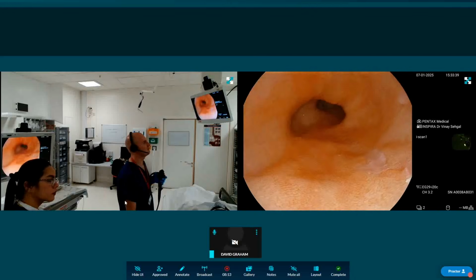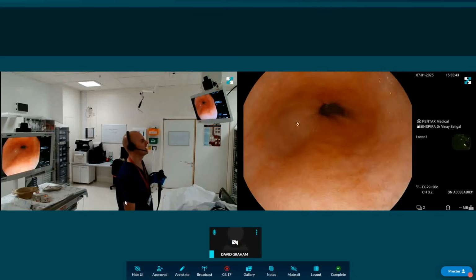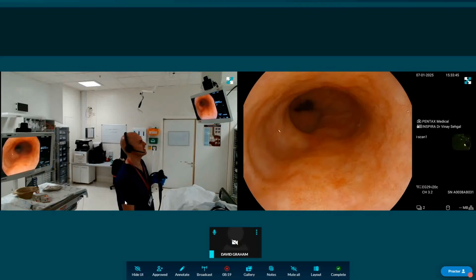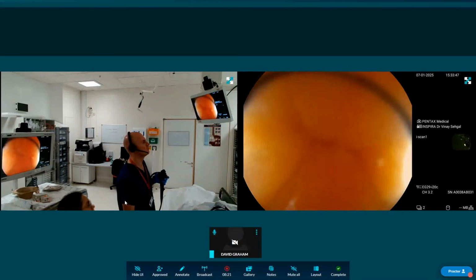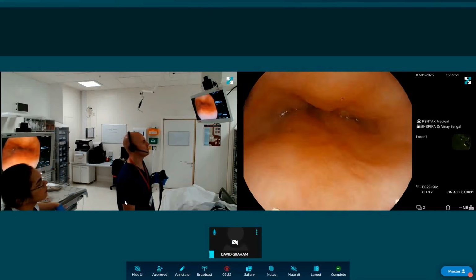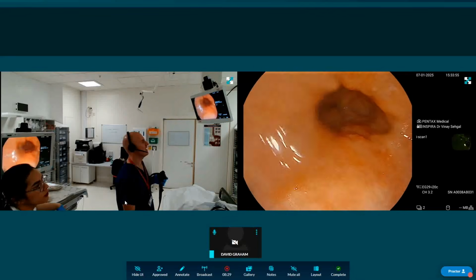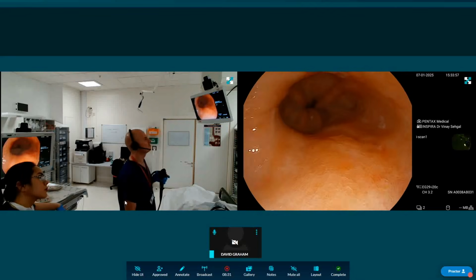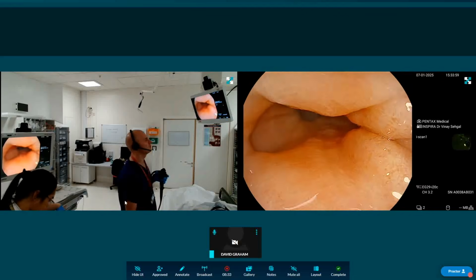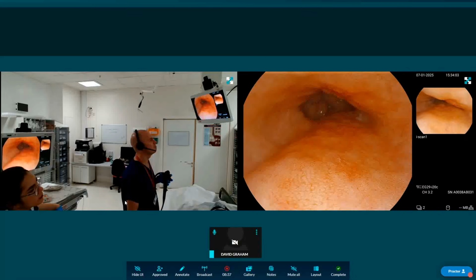Now, as we're pulling back here for our measurements, we're also looking around for any obvious signs of dysplasia, and that's any nodularity, any ulceration, any friability, any problem with the way the wall is moving from a peristaltic point of view. And I hope that most people can see there is an area of dysplasia here. It's fairly, I'd say, fairly obvious. If we just pause, let me just let this wall just come here, and then we just pause there.